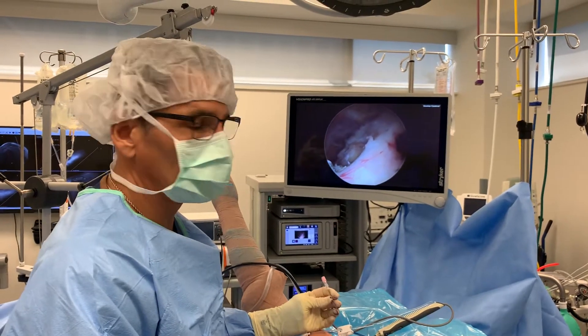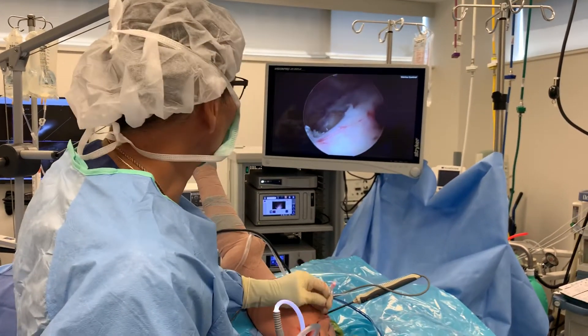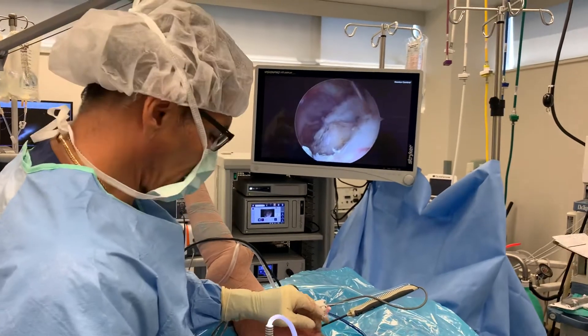Dr. Maura here, bringing you more cutting edge orthopedic surgery. Left shoulder arthroscopy — definite rotator cuff tear, that's what we're at right now.